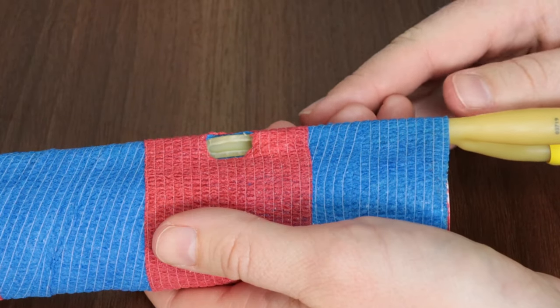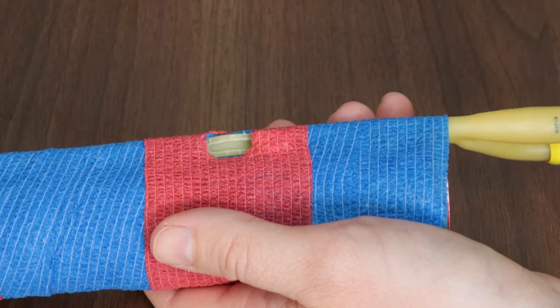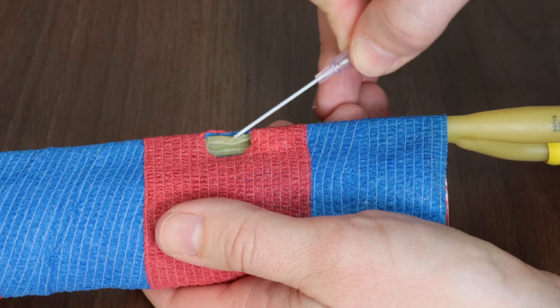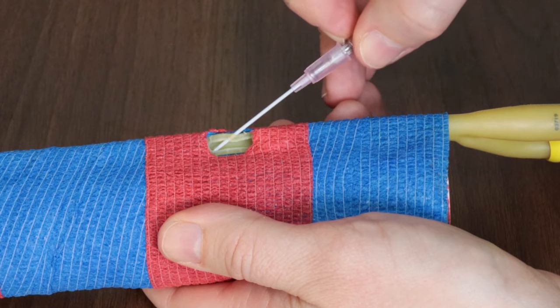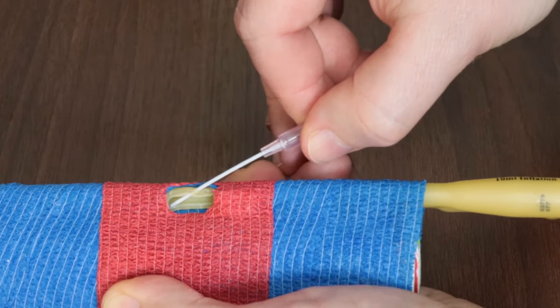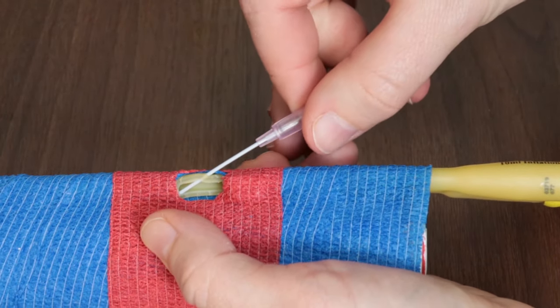In our second example, something you may have heard multiple times is you burred it, pull it out, let's start over. So what that means is you may have ended up stuck down on the opposite side of the vein wall here and your catheter runs into the vein wall, or even totally outside of the vein and any of the structures around, and then your catheter won't advance.